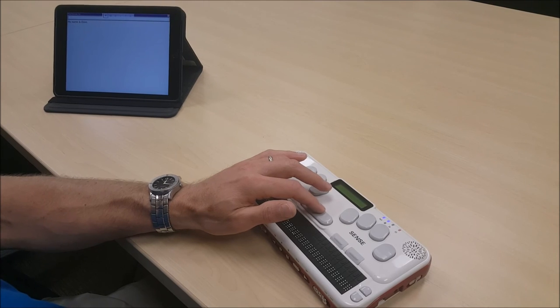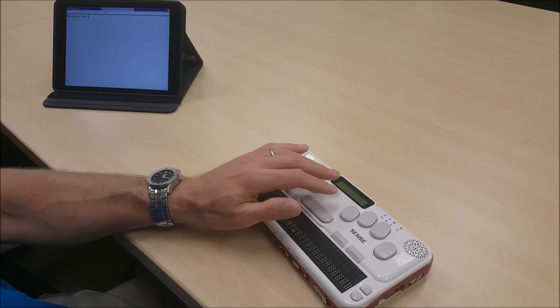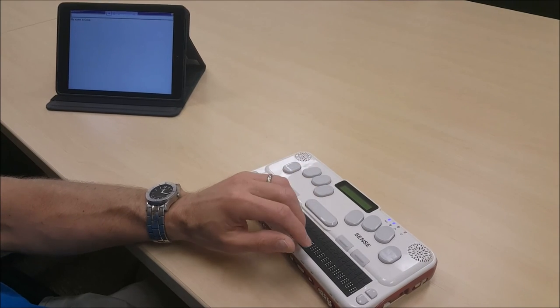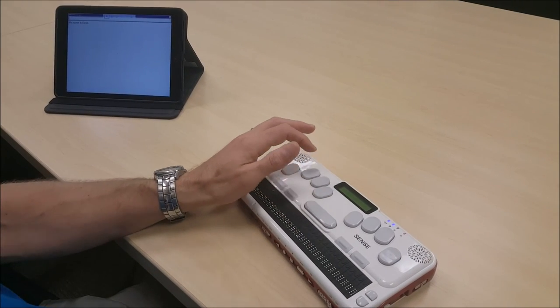One more example to do is say line. I could press space, dots 1, 4, followed by space. My name is Dave. And now I know that my name is Dave.